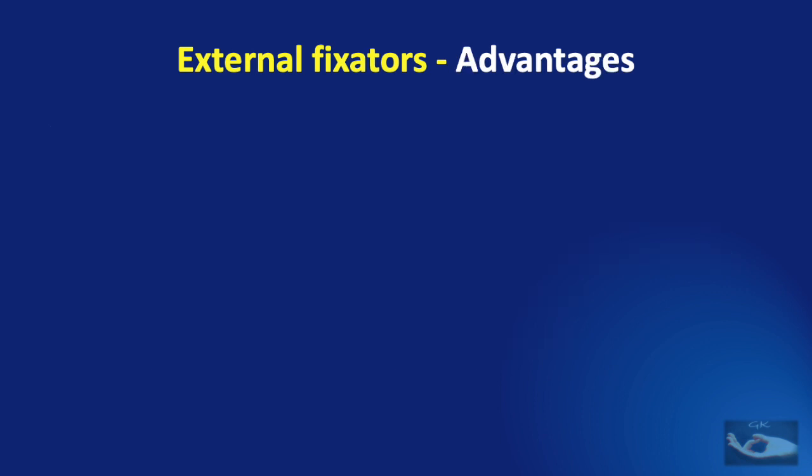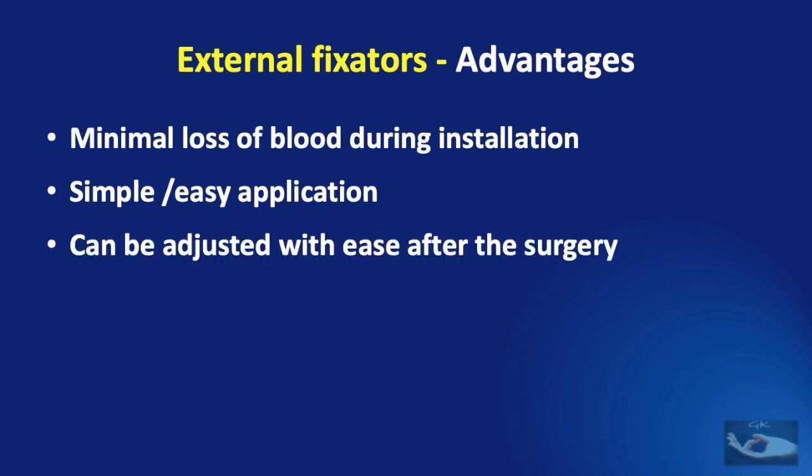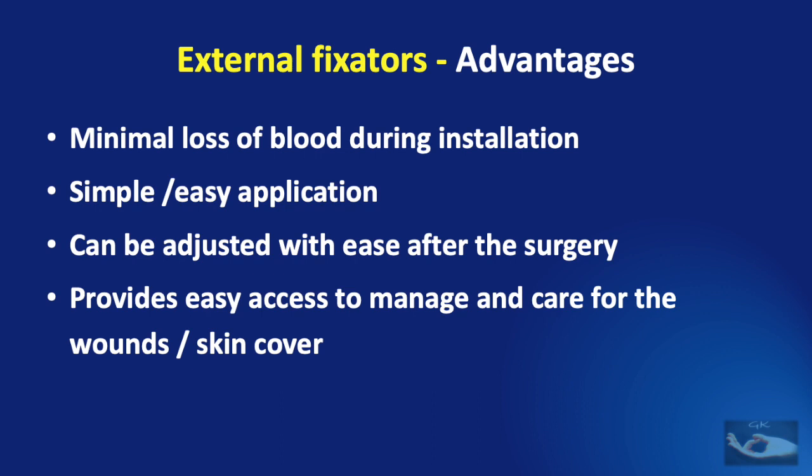The advantages of using external fixators are that there is minimal loss of blood during installation, simple and easy application which can be adjusted with ease after the surgery, and it also provides easy access to manage and care for the wounds and sometimes even provide the skin cover.